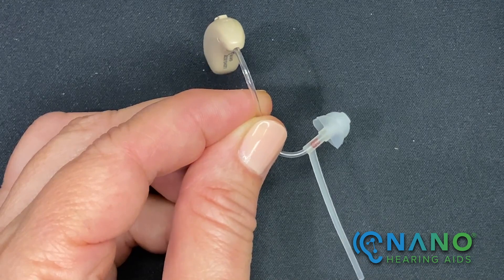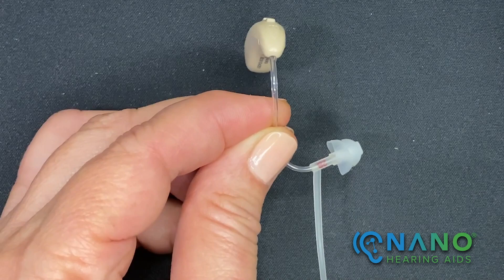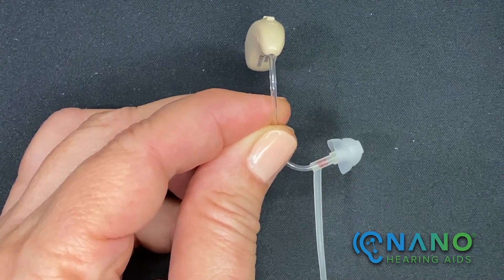At the tip of the thin tube is the third component, the dome. Your dome may look slightly different, but the dome is the portion that is placed in your ear canal.